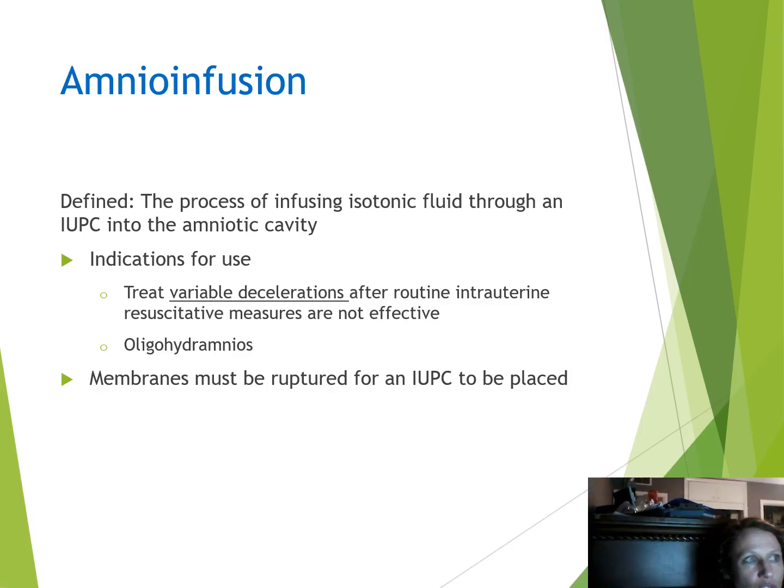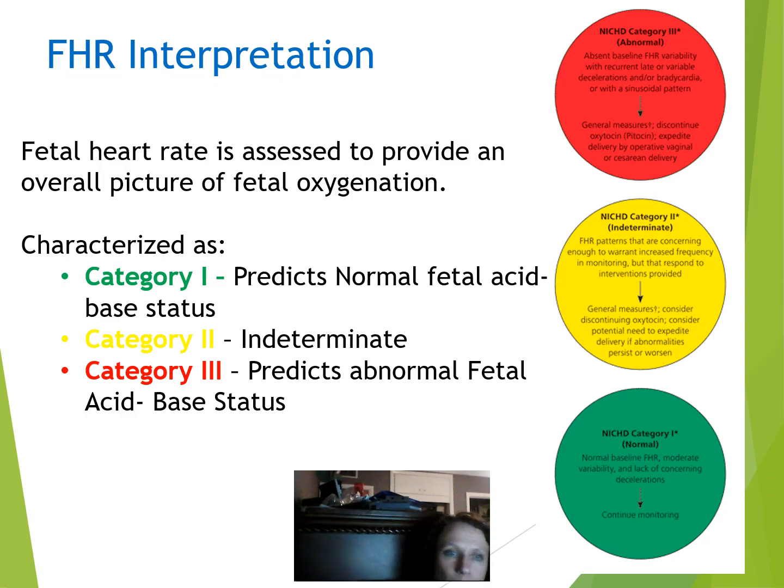The concern about amnio infusion though is that if you're putting fluid in, that fluid needs to come back out. So you need to make sure you're paying attention to the fluid coming back out. Every single facility should have some sort of policy and procedure about how to do it. I'm not going to quote one because there's very different information out there.